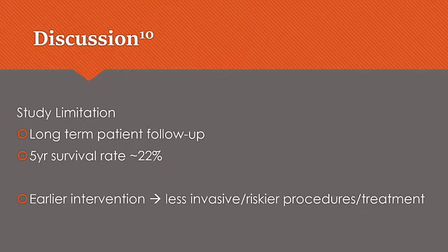Long-term patient follow-up is a study limitation of this trial, as the 5-year survival rate of brain cancer is only 22%. This highlights the aggressive nature of the disease and how early detection of residual or recurrence could play a crucial role in patient prognosis. 18F FET PET MRI has greater diagnostic value for early disease detection, allowing for swifter intervention, and also may negate the need for more invasive procedures like biopsy, which have higher risks of adverse events.